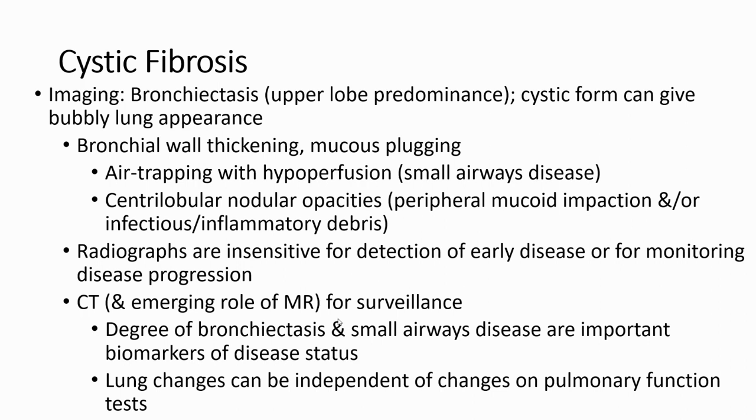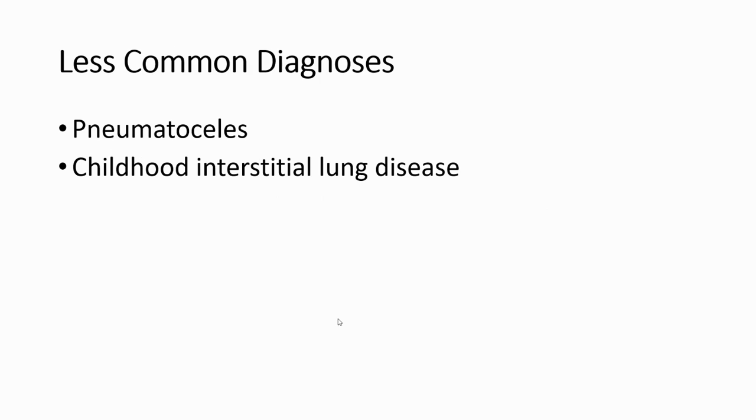In radiograph, it is insensitive for detection of early disease or for monitoring disease progression. CT and emerging role of MRI for surveillance. Degree of bronchiectasis and small airway disease are important biomarkers of disease status. Lung change can be independent of changes on pulmonary function tests. So we just finished the more common causes of bubbly lung.